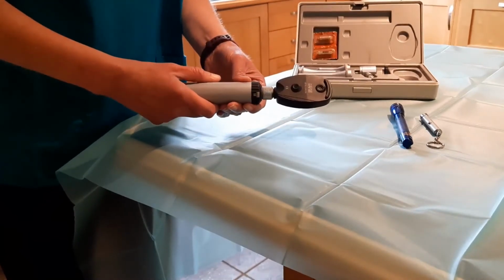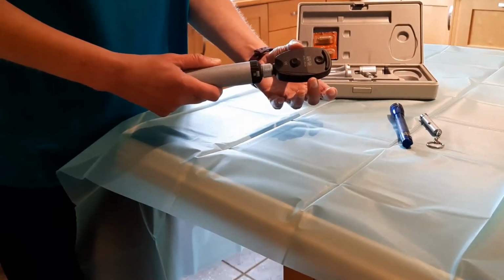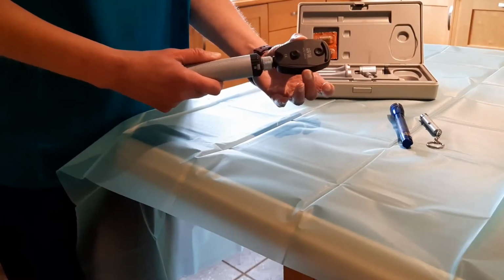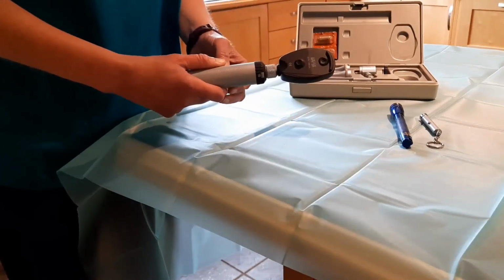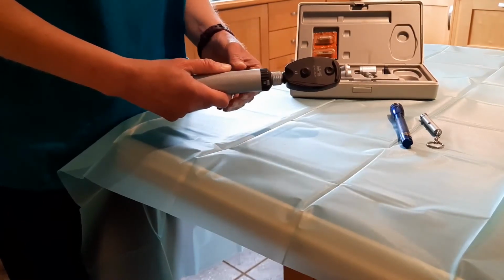Vets will use the ophthalmoscope to examine various parts of the eye. So there's a number of different lenses in this ophthalmoscope head, and you change these by rotating the vertical dial. So if you're setting this up for a vet to use, it's a good idea to rotate the vertical dial until you can see a black 0 in the window here. And that stands for the 0 diopter lens, which should allow the retina to be in good focus.